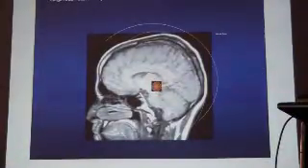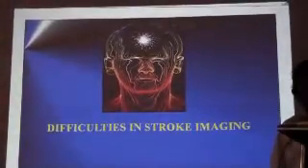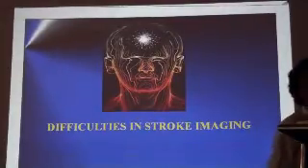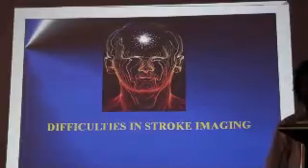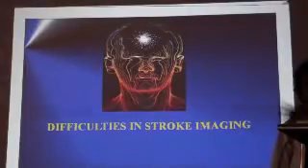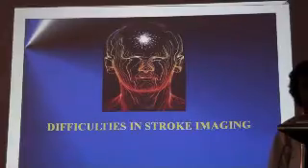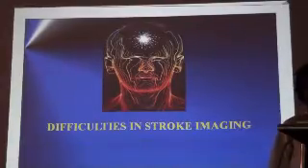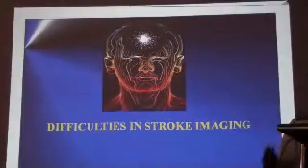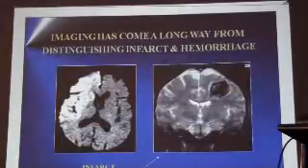Basically, focused ultrasound is not done in our country. Now, the difficulties we face in stroke. I told you, do CT for hemorrhage. If the patient came 6 hours later, there is no scope for thrombolytic therapy. Again, you repeat the CT, you will get the obvious changes. But our aim is to save the patient from damage as far as possible. So, these are the difficulties we face.